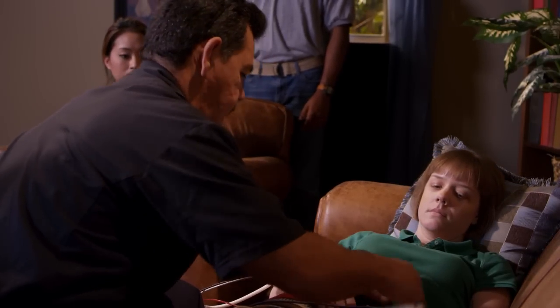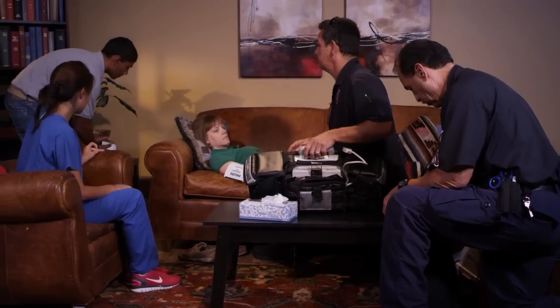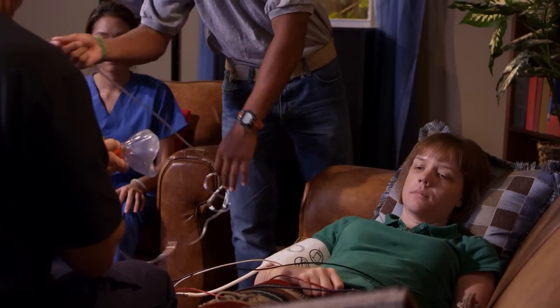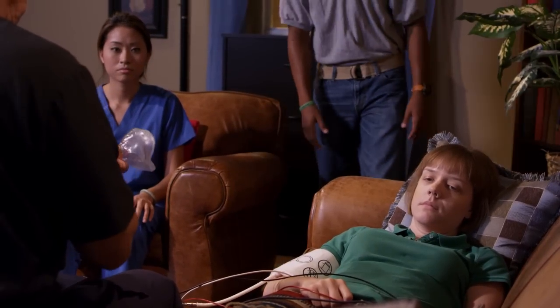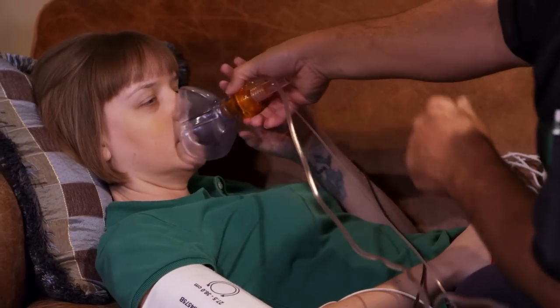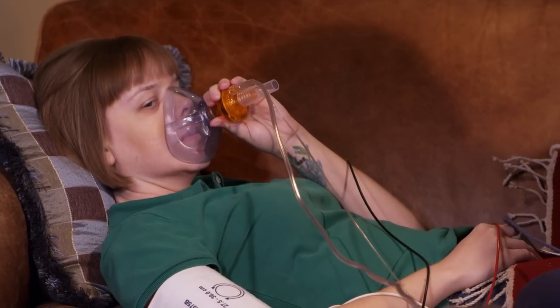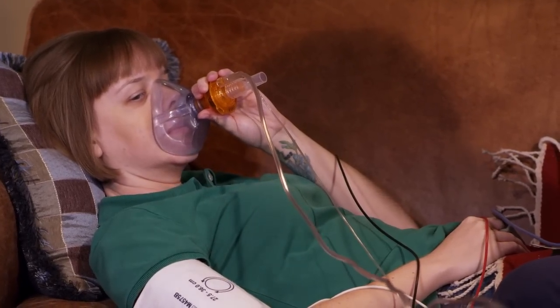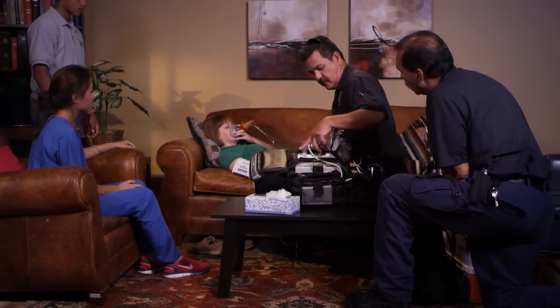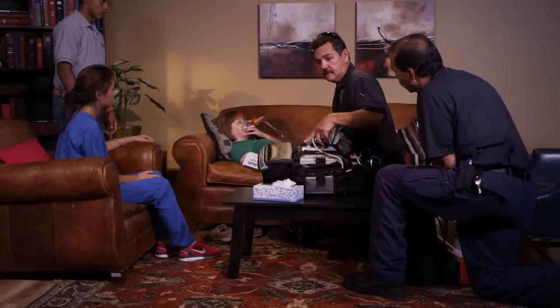Blood pressure's going. Partner, right now she is hypotensive and tachycardic. Blood pressure of 80 over 36. Jacob, let's get the ResQGARD going on her. Ma'am, can you use your hands to hold the... Yes. Just put it on your face, get a few puffs, get another blood pressure. Okay, right now, her blood pressure is 100 over 56.